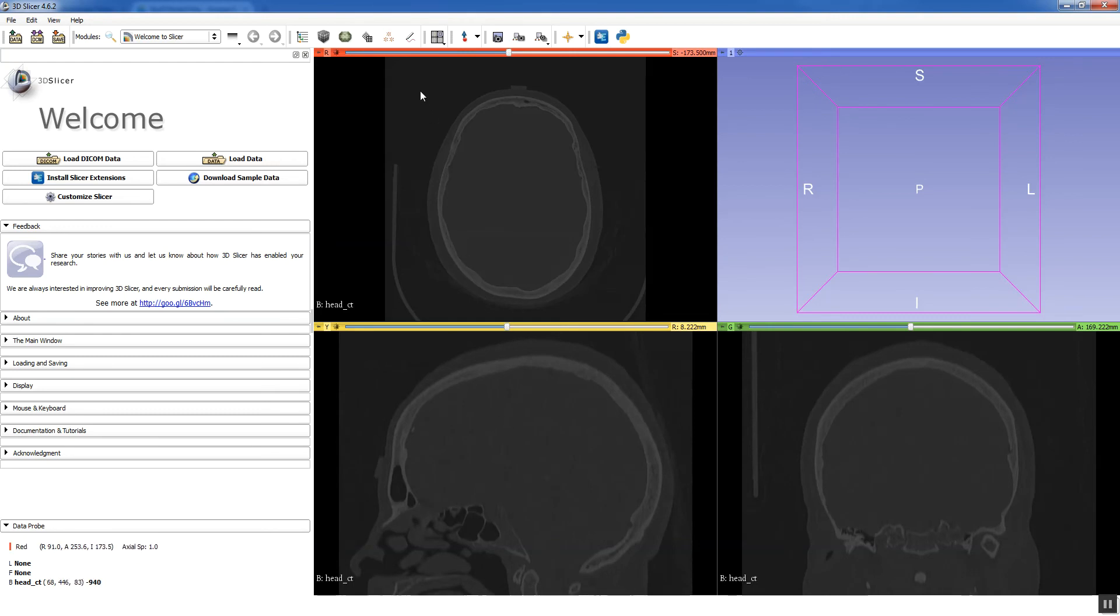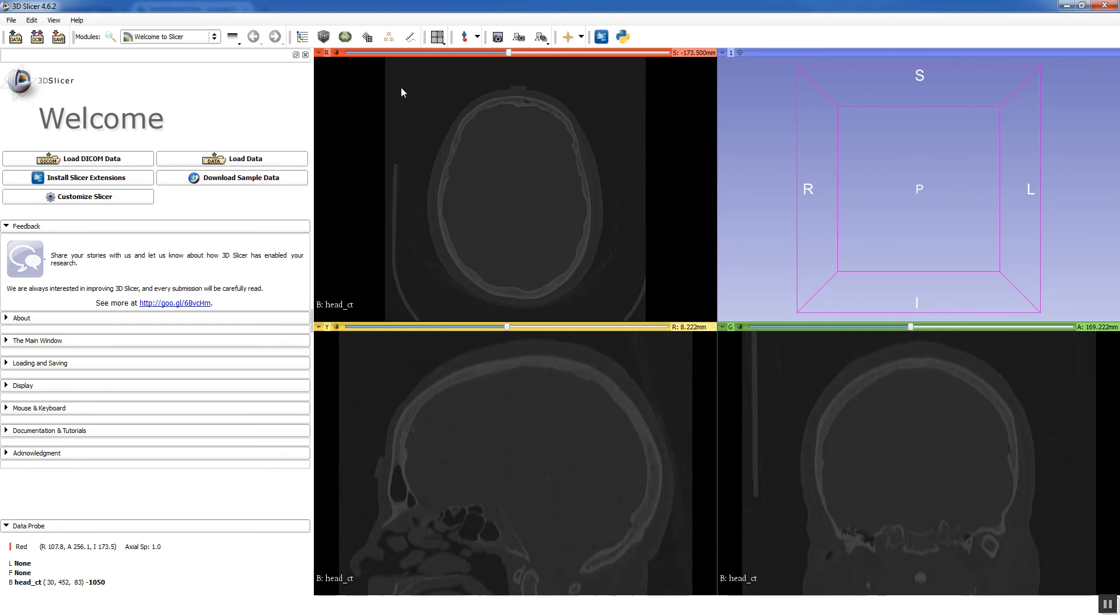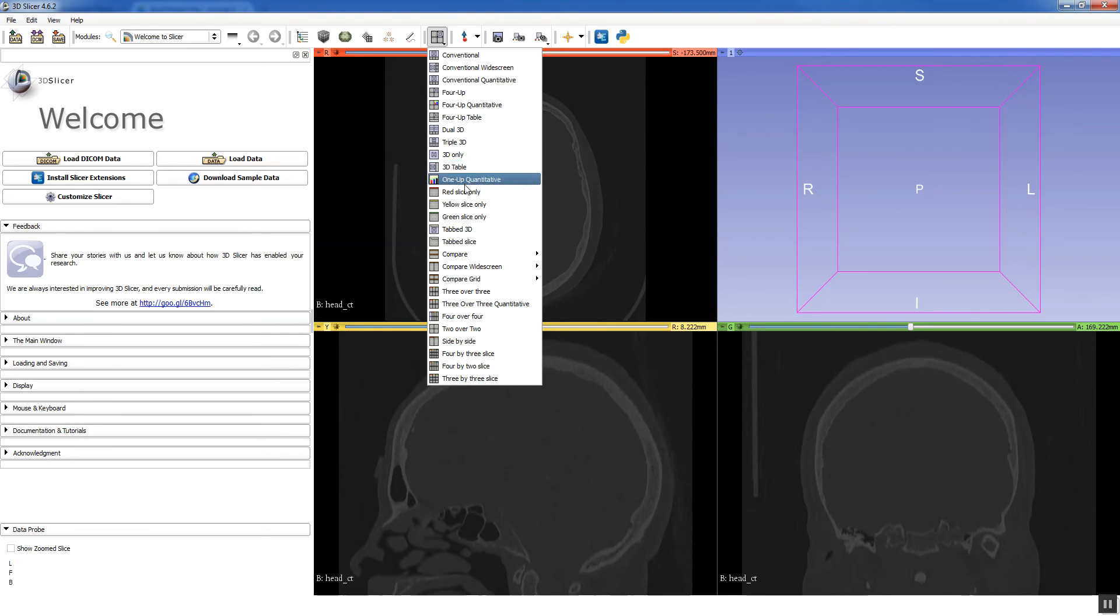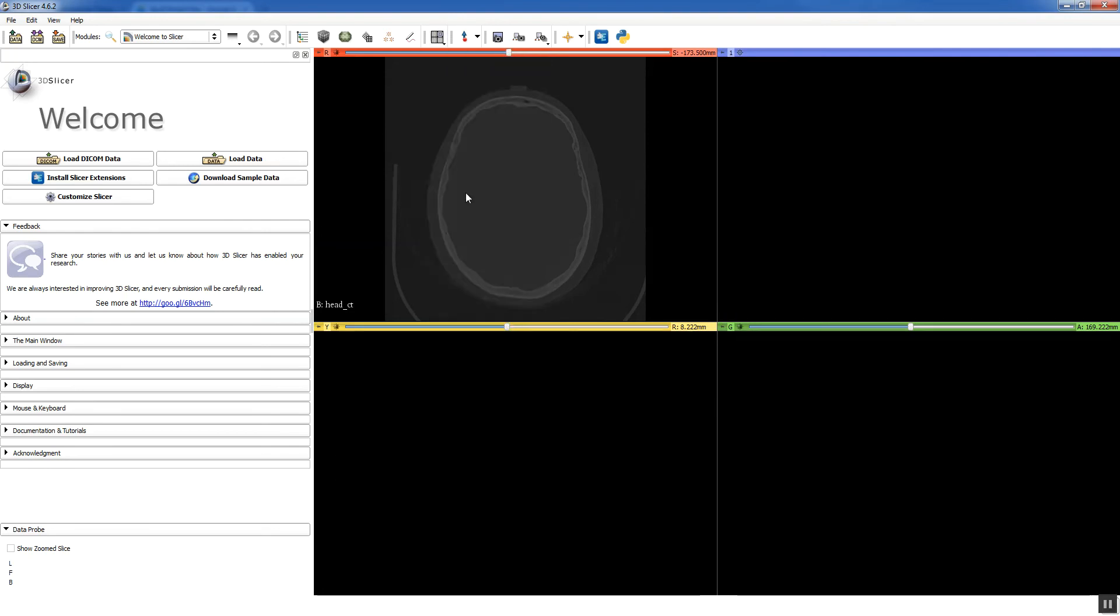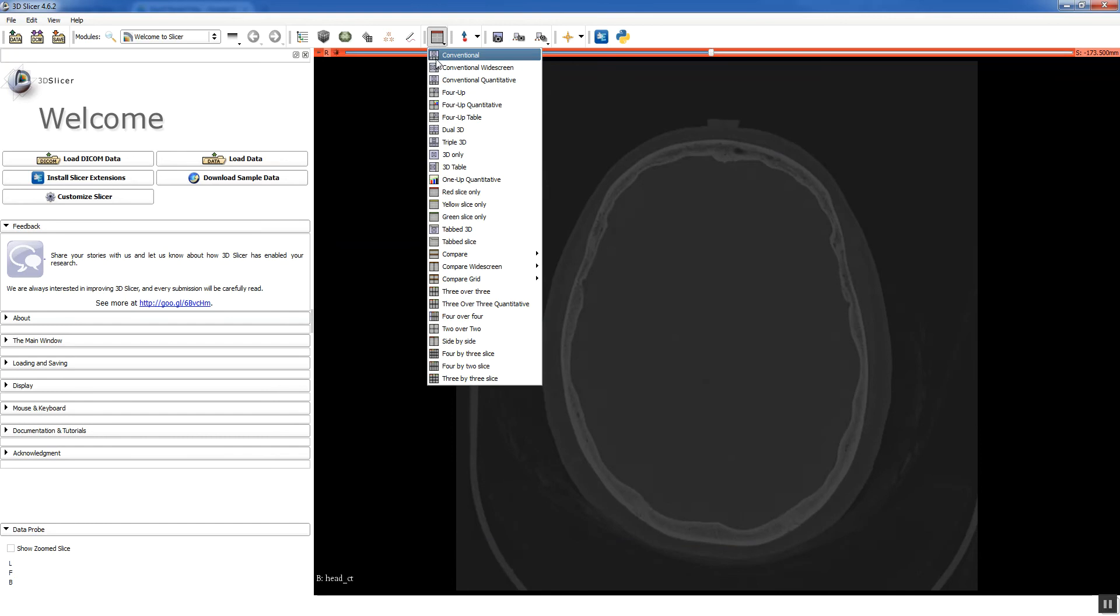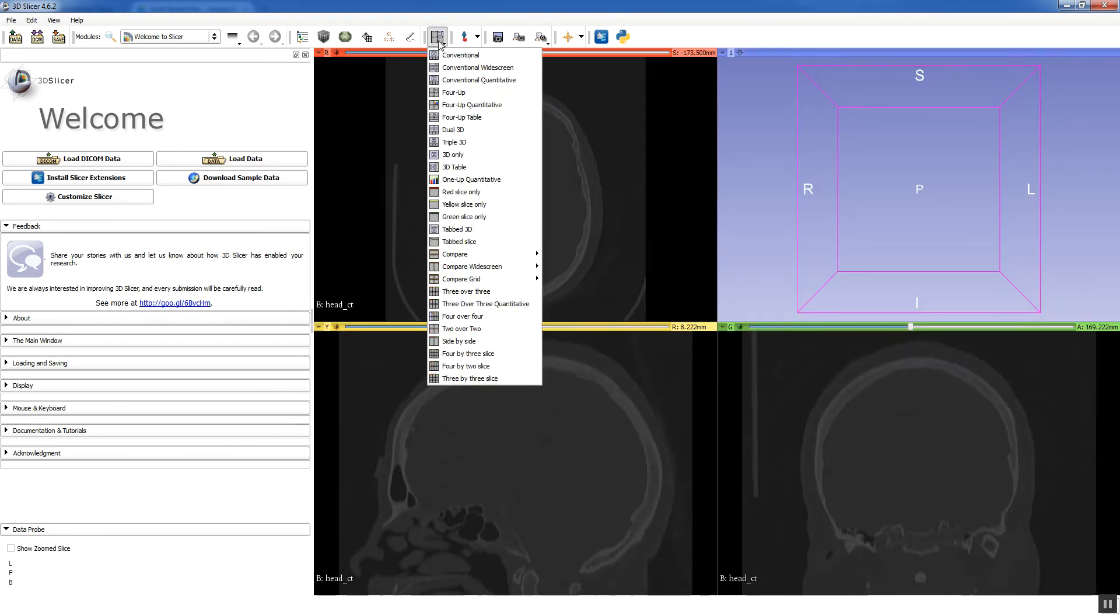And you see that the head CT opens up. Now Slicer by default gives you this kind of view where you have three different windows and then this is for viewing the 3D models. A couple controls in Slicer that are important to be aware of. This is a big one here. This controls how you're displaying your data. Say you only want the axial slice. You can say red slice only. Or if you want to go back to where you were, you click 4 up and that gets you back to where we were.